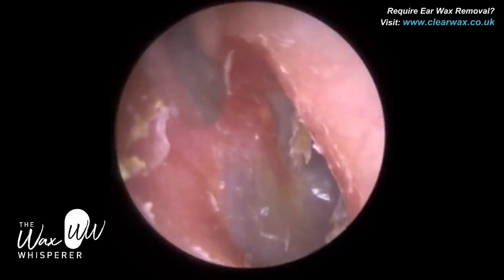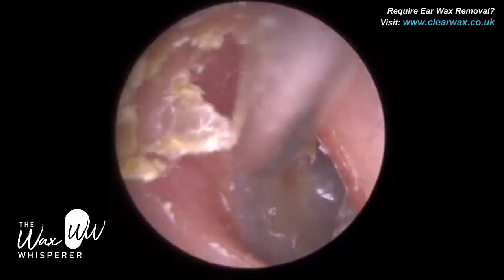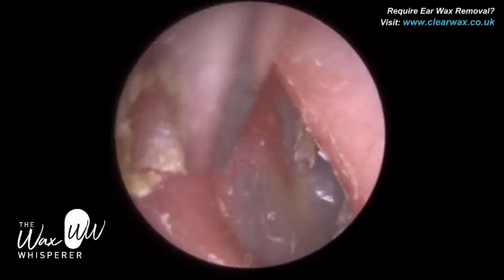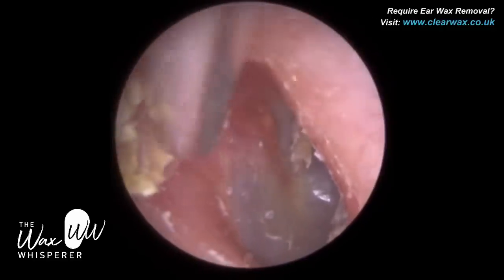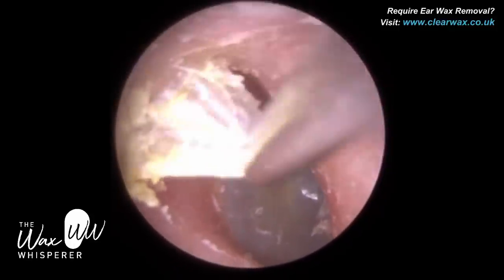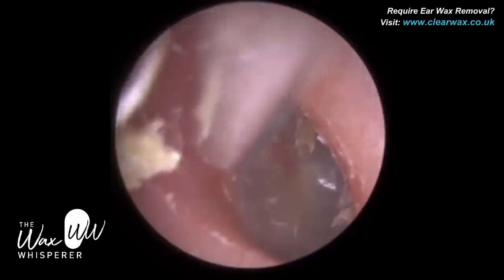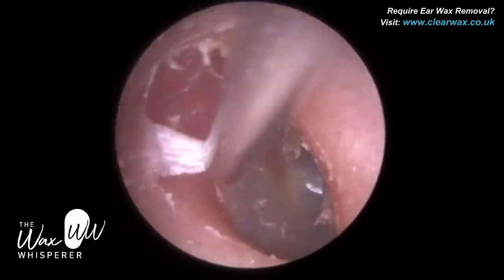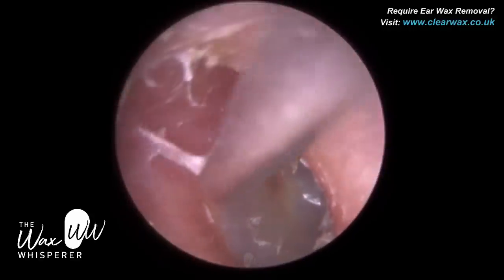We've got the endoscope, which is 2.7 millimeters in diameter, and the Zonas suction probe, whose internal lumen is 2 millimeters — so with the tube wall, probably around 2.4 millimeters. It's sometimes very difficult to insert instrumentation in the ear, and it's one thing inserting it, but then having the ability to manipulate and maneuver the fine end up and down, left and right to peel the skin off. In this particular patient it was quite tricky because she had a very narrow ear canal entrance, which provides less space to operate inside.